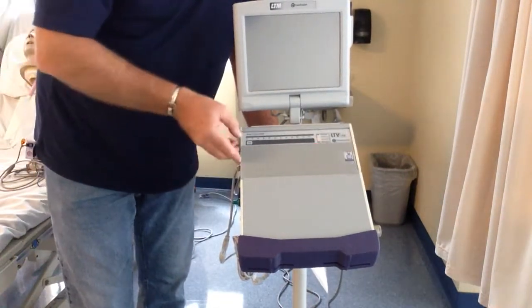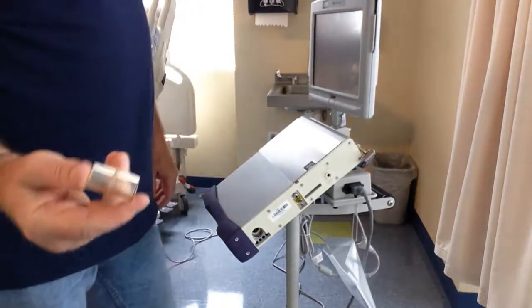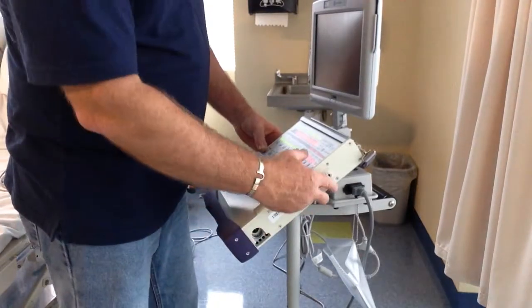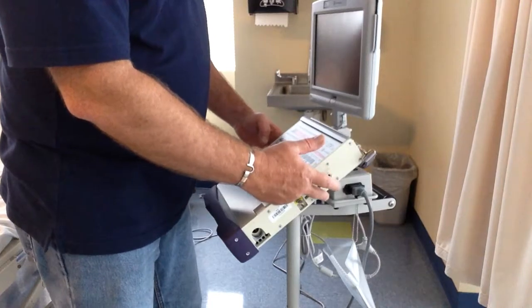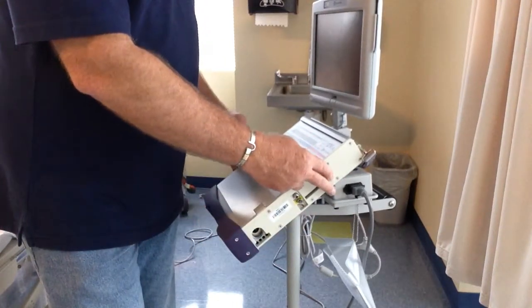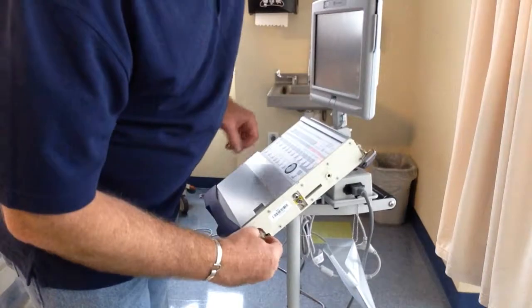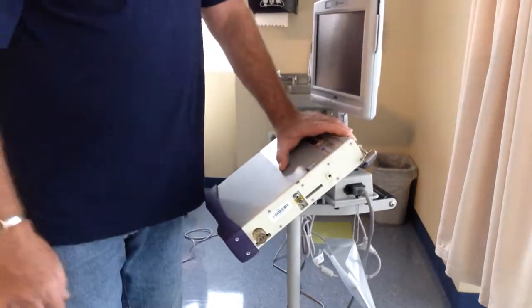Your controls are right here — we will go over those in a different video segment. The speaker is this little hole. Why is that important? If you put tape over it, you can't hear it. You need to know where the speaker is in case it gets muted. Somebody may have put tape or gauze over it — that has happened in a facility I've worked. We had somebody put gauze and tape it over because the ventilator was too loud.